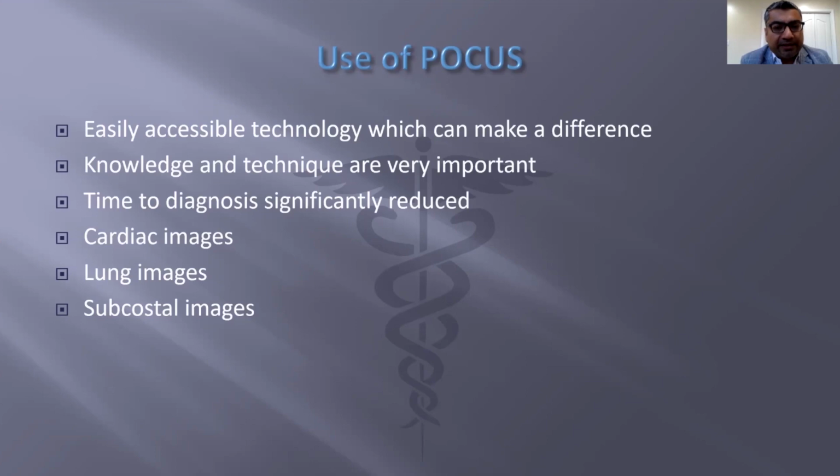So knowledge and technique are very important, because if you don't use the proper technique, you can misdiagnose many patients. The biggest advantage of POCUS is that time to diagnosis is significantly reduced, because you have it at the bedside. You don't have to wait for a technician or for an echocardiographer to come, which may take an hour or more.